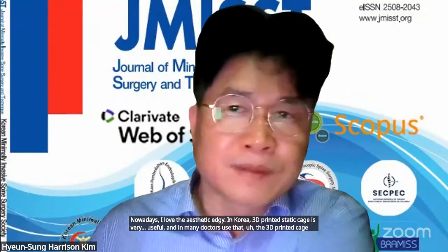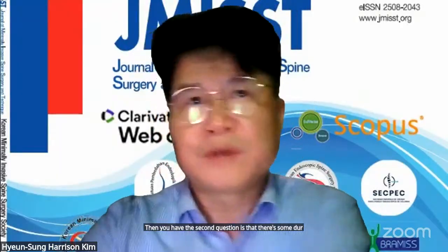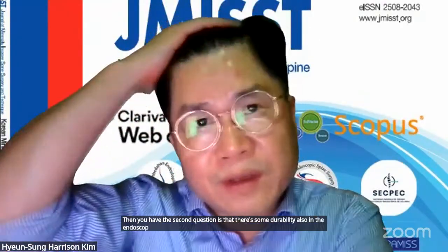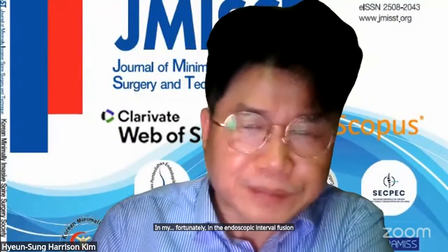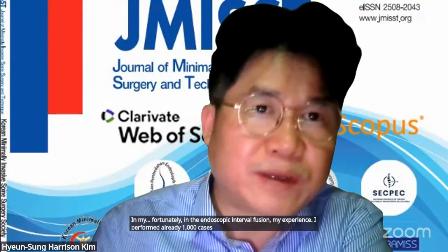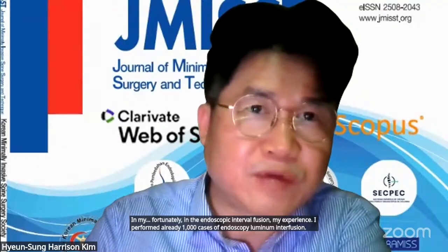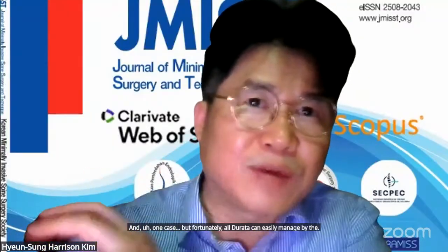That was the first question, and your second question is about dural tear. Dural tear in endoscopic lumbar interbody fusion and endoscopic decompression can commonly happen. Fortunately, in my experience, I have performed already 1,000 cases of endoscopic lumbar interbody fusion. There were three cases of dural tear, and fortunately all of them were easily managed by TachoSil attachment.